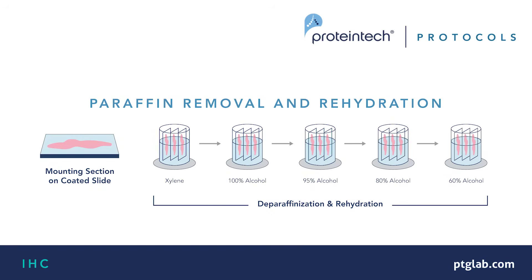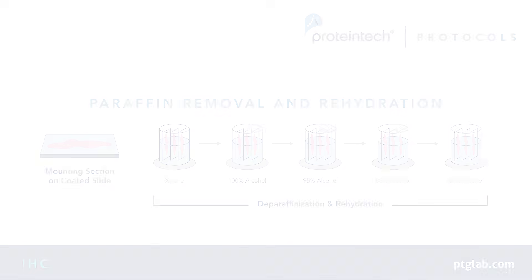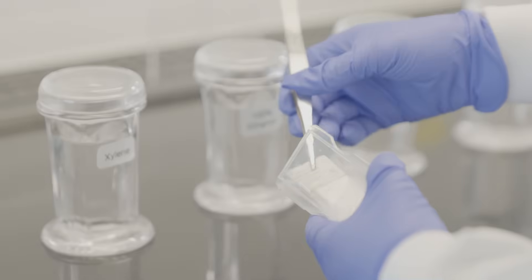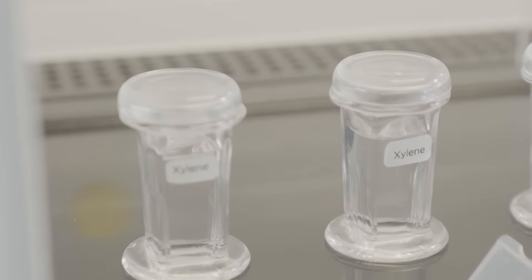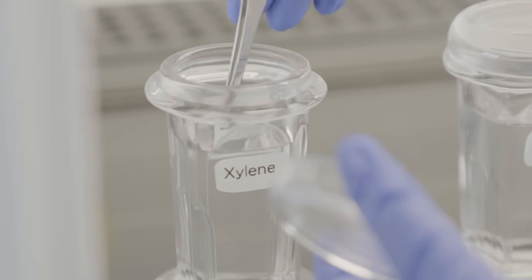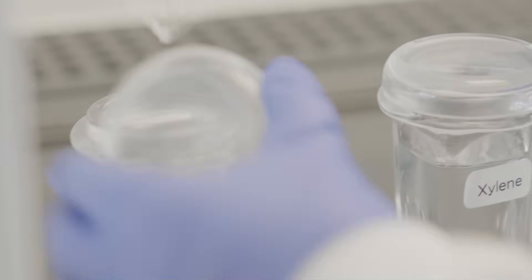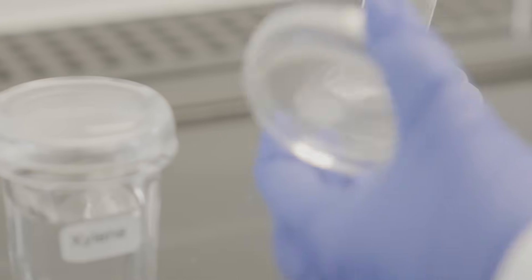Before staining can commence, the wax coating needs to be removed and slides need to be rehydrated. Start by immersing slides in xylene for 10 minutes. Transfer slides to fresh xylene for a further 10 minutes.